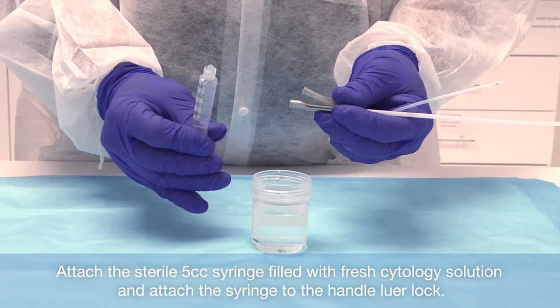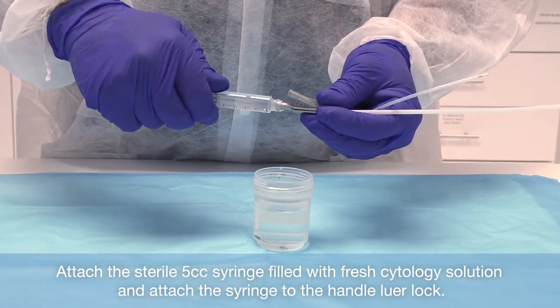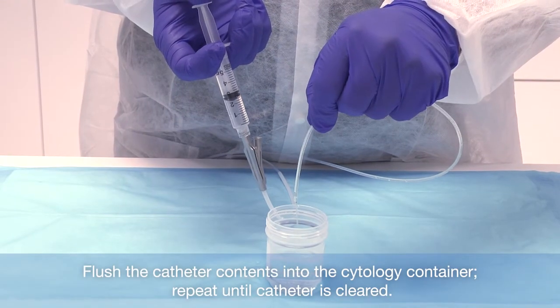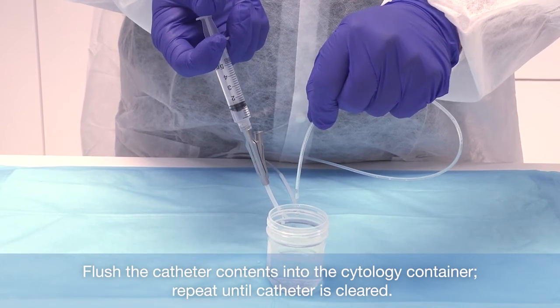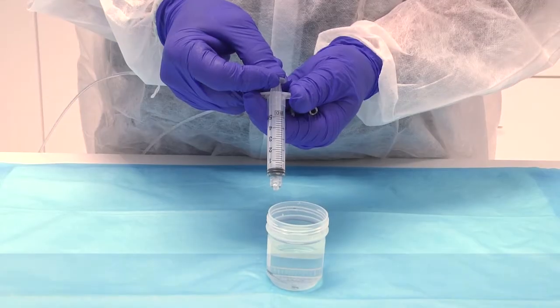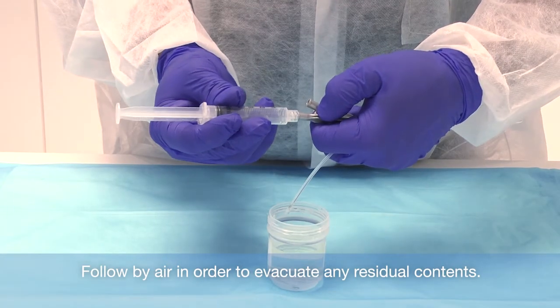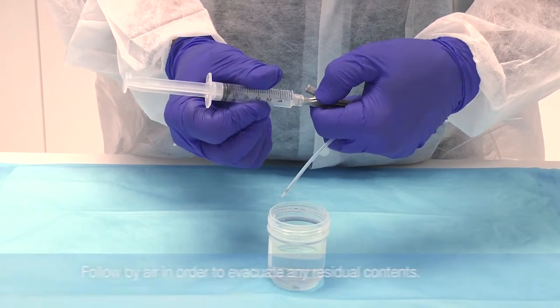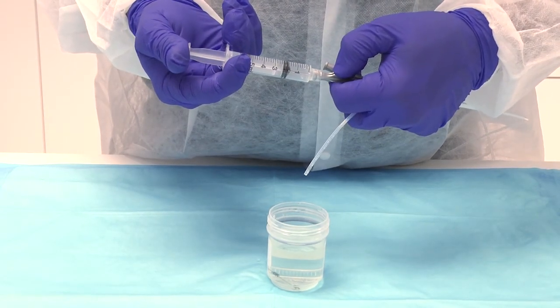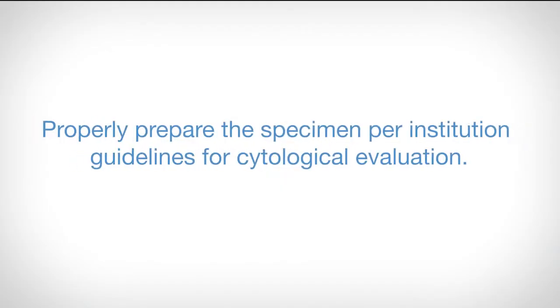Attach the 5cc syringe filled with fresh cytology solution to the handle lure lock. Flush the catheter contents into the cytology container. Repeat until the catheter is cleared. Follow by purging air through the catheter in order to evacuate any residual contents. Properly prepare the specimen per institution guidelines for cytological evaluation.